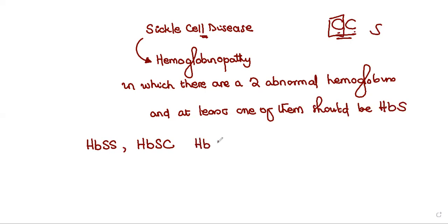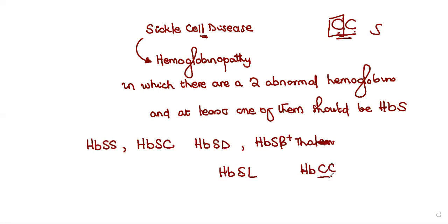HbSD is also sickle cell disease. HbS beta thal, it's a sickle cell disease. HbS, let's say L, is also a sickle cell disease. But HbCC, do you get it? Yes, Doc. HbCC is not a sickle cell disease, but it is a hemoglobinopathy. It is not a sickle cell disease because none of the hemoglobins is an S.